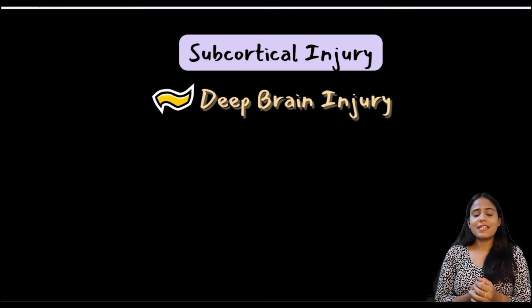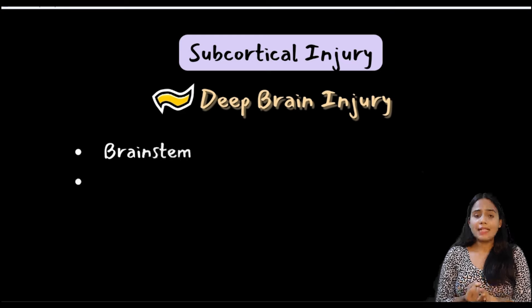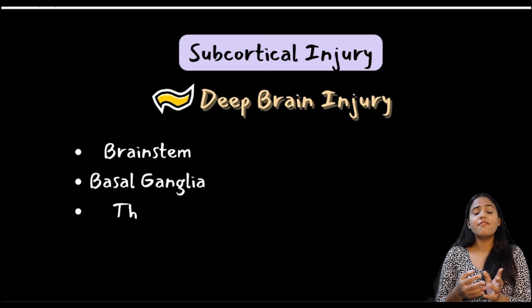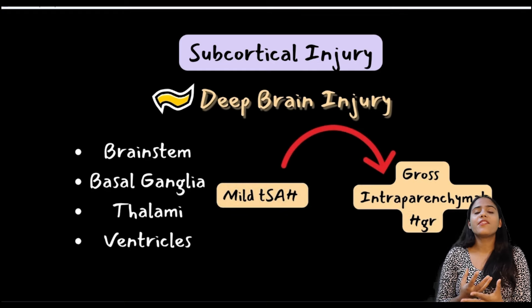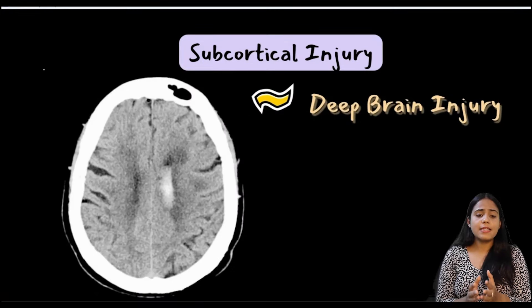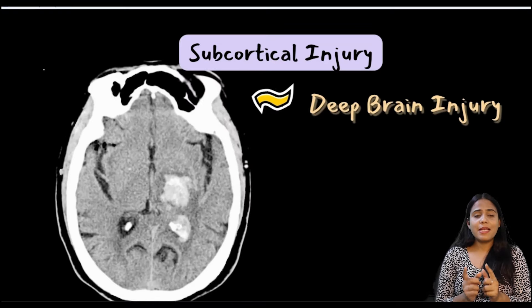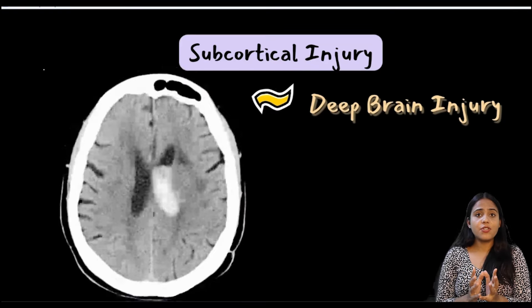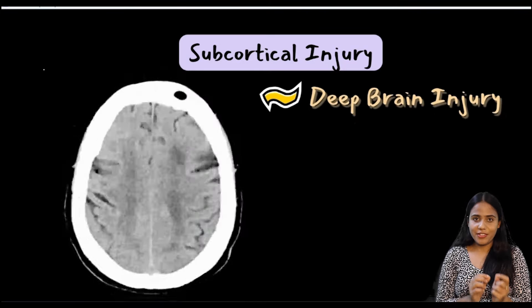Moving on to subcortical or deep brain injury, where the deeper brain structures are involved — including the brain stem, basal ganglia, thalamus, and even the ventricles. These may range from mild traumatic subarachnoid hemorrhage to a gross intraparenchymal hemorrhage. This scroll set shows a large intraparenchymal hemorrhage in the left basal ganglia region with extension into the left lateral ventricle, where the blood forms a cast in the lateral ventricle.